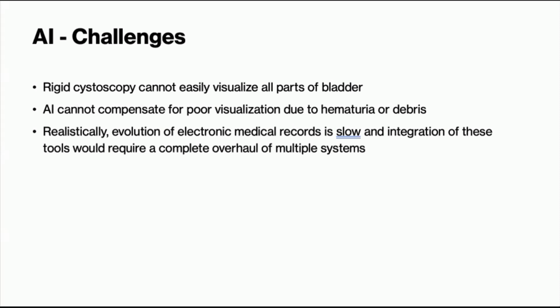And then this is more of a discussion around where the future of follow-up might look like. But if we do end up wanting to integrate 3D bladder maps as a means of follow-up, we're going to need a complete overhaul of our systems, because the small computers at the hospital, at your office, they're probably not equipped to take on this vast amount of imaging and data. And to upload to the cloud is going to require an overhaul in terms of our EMR systems.